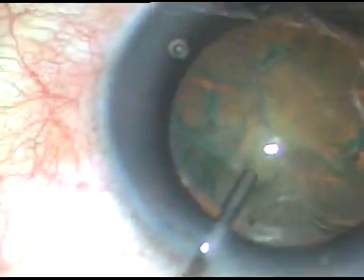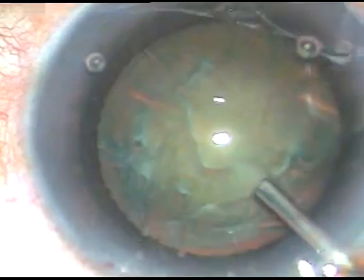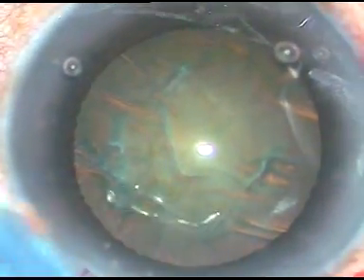In this case, hydrodissection has been done and the nucleus has been mobilized. Now it is time to enter into the eye. I'm going to show you how to hold the nucleus and how to chop it with your chopper. Remember, this is the ideal density.